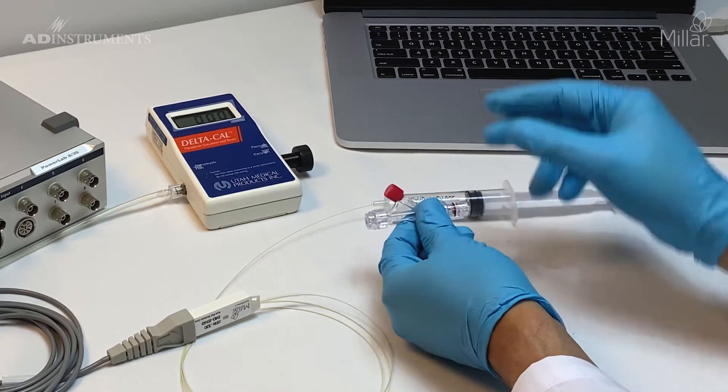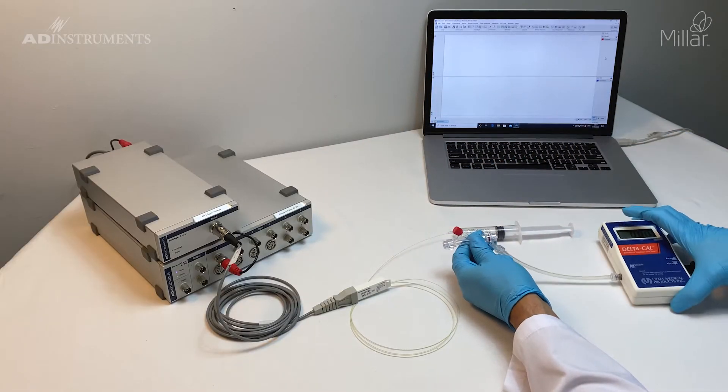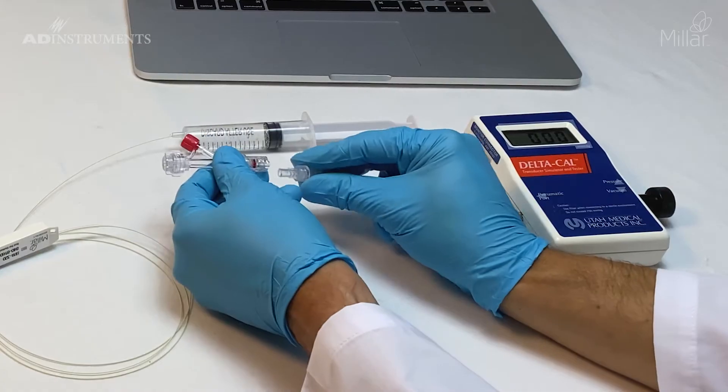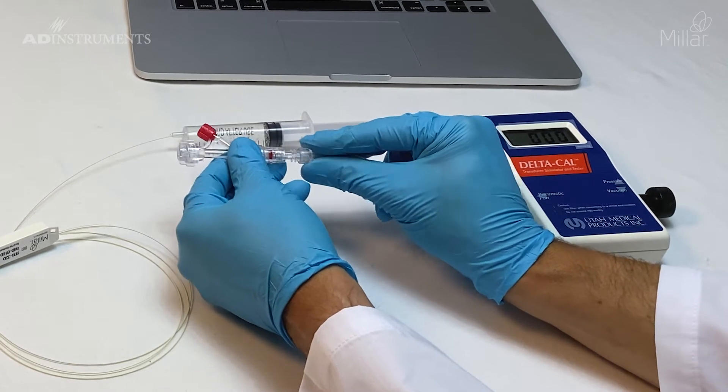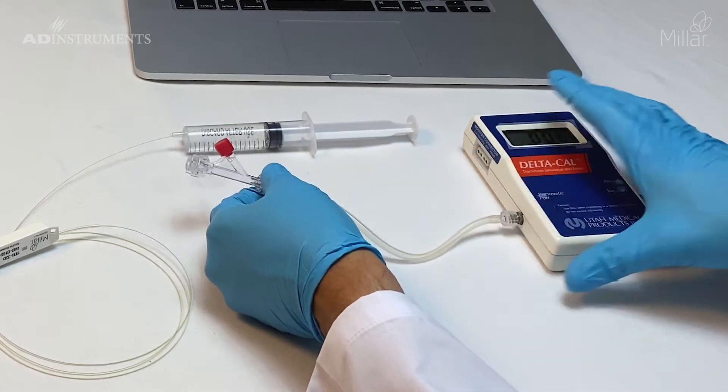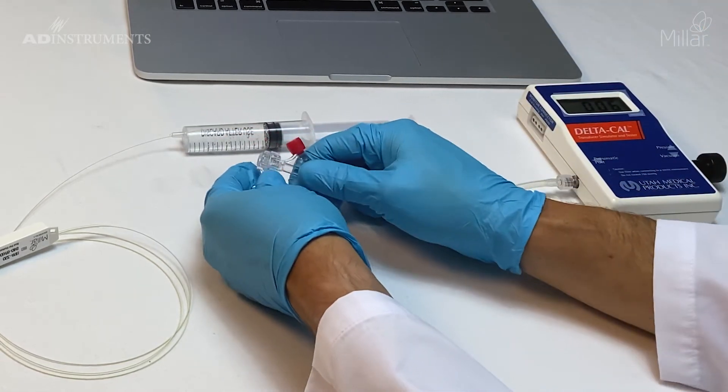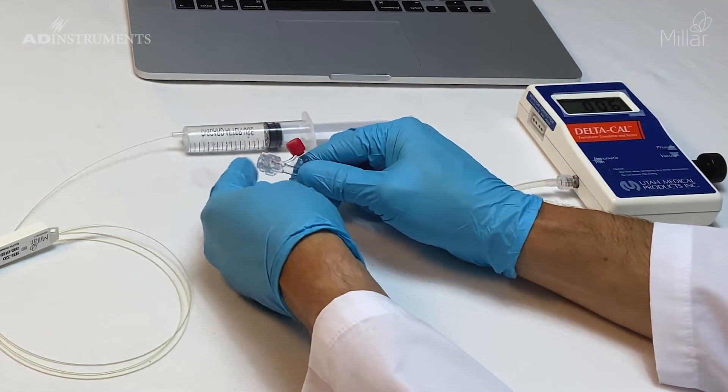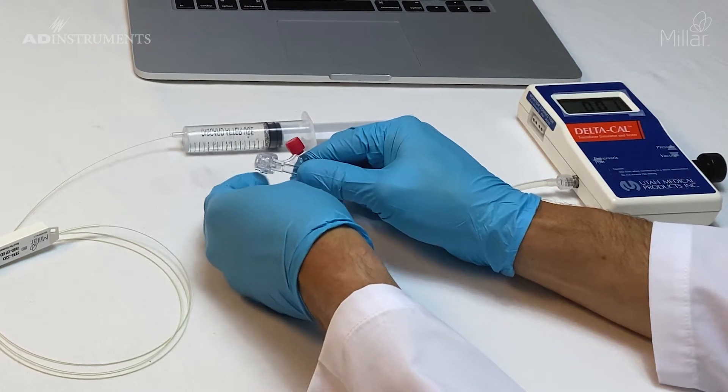Now I'll attach the hemostatic valve to the DeltaCal, making sure it's a tight fit, then open the valve all the way.